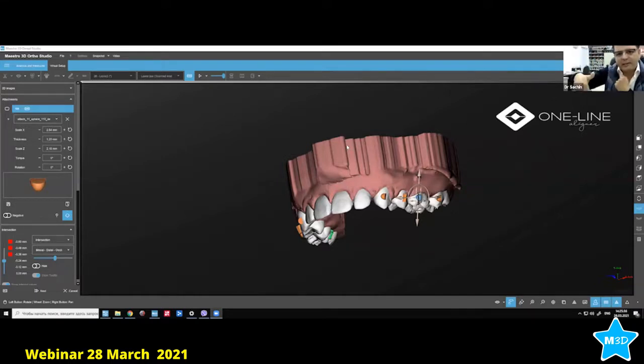That's where we need power ridges or negative attachments. So what we did was power ridges with the pliers. We have a set of 16 pliers, different pliers for different movements, and negative attachments on the tooth, on the gingival part of the upper teeth, or on the incisal palatal side, to get the movement.